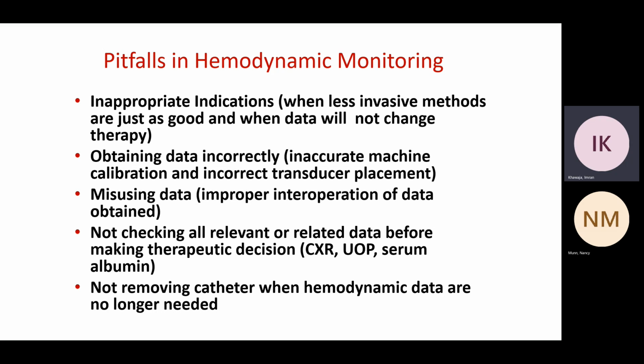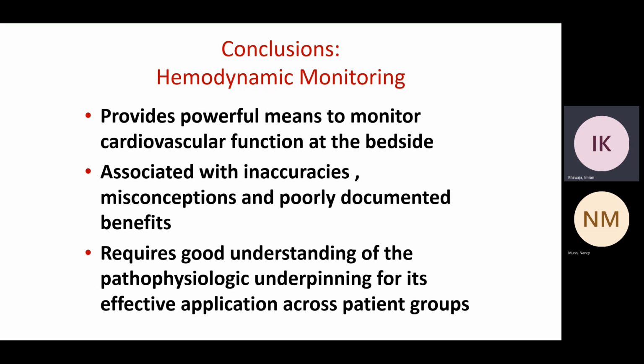The other thing is to get your catheter out once there is no further need for it. We've seen patients develop bacteremia with the catheter left in place for a few days. There is incremental risk of infection: the longer the catheter stays in place, the higher the risk. Nonetheless, regardless of all the controversy, the catheter is a very powerful means to monitor cardiovascular function at the bedside.